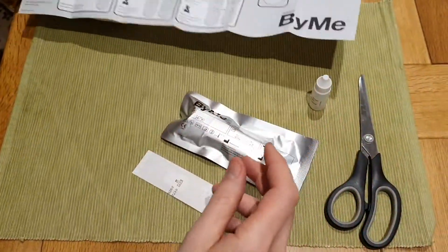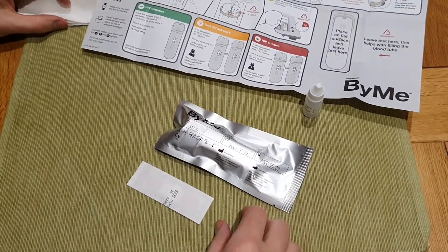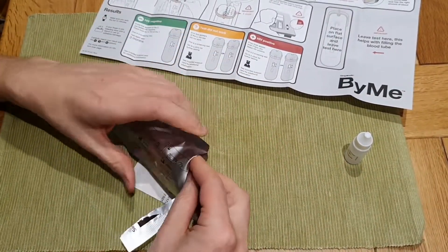This is a screening test, so any point of care test you do, it's very important to realise that they're just screening tests. Okay, so let's open the test and let's do it.